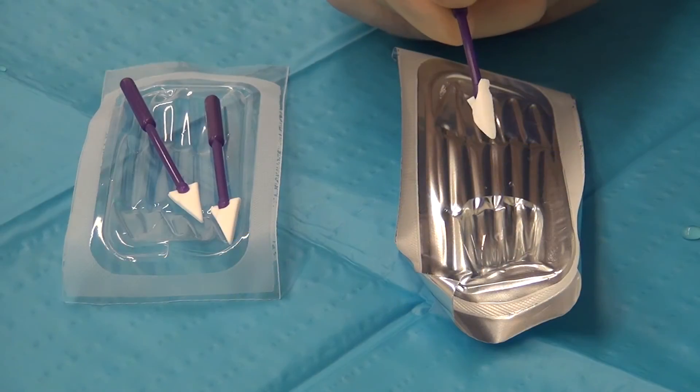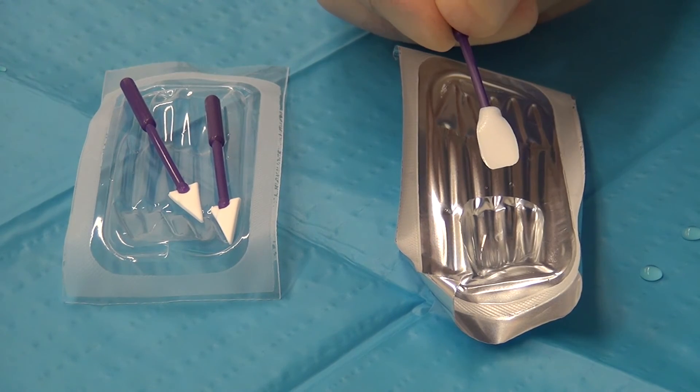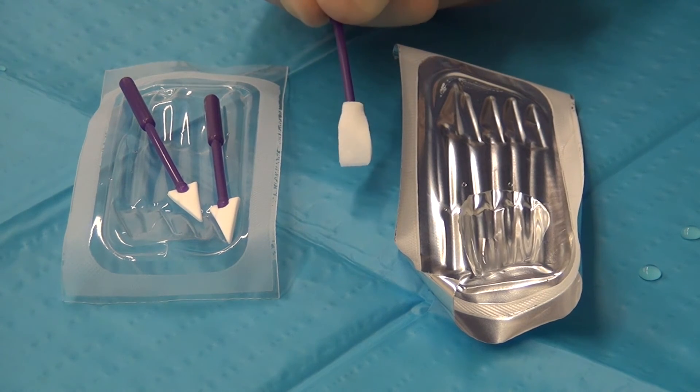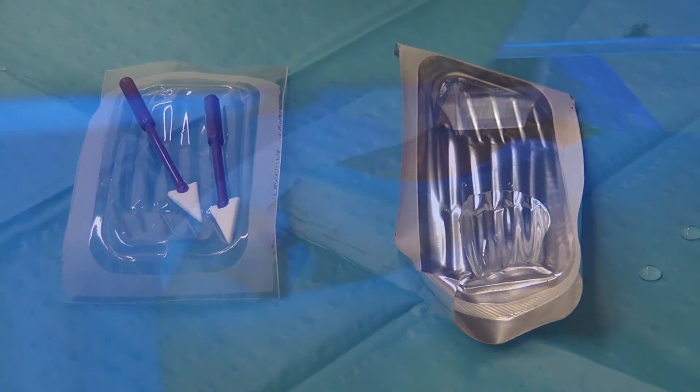In order to remove everything that could be floating on the cornea, wipe the cornea with a wet microsurgical sponge. The trick is to first wet the sponge and then squeeze it. This will give the perfect instrument to remove all debris and lint from the surface without leaving the cornea too dry.